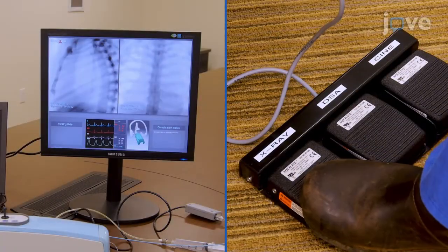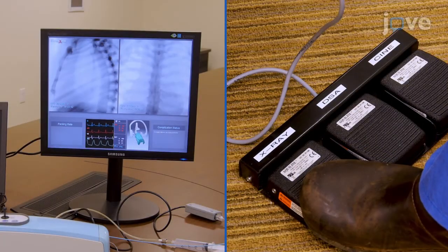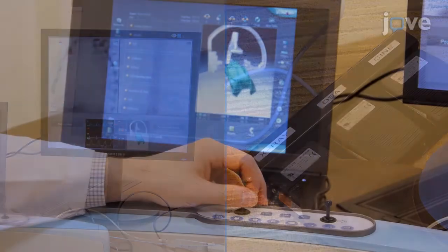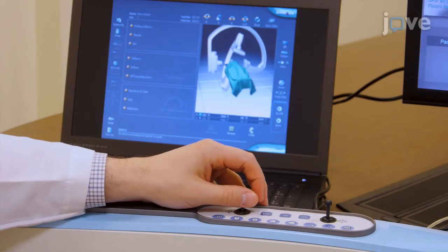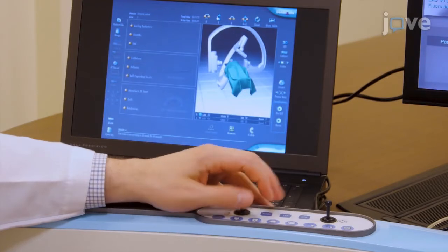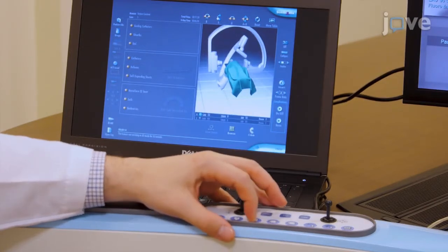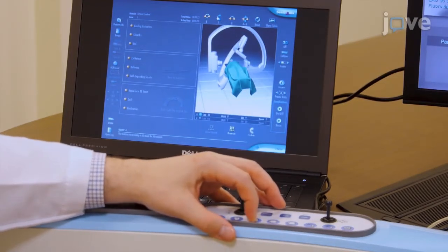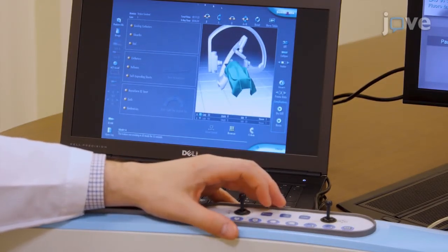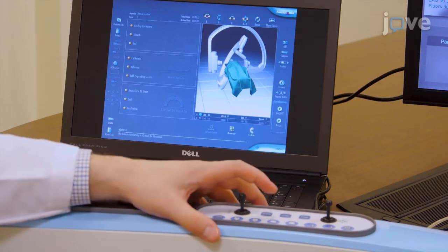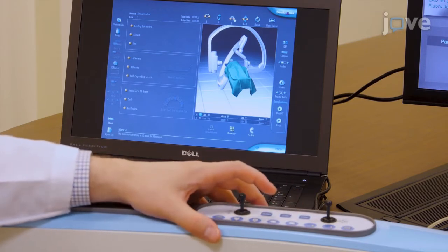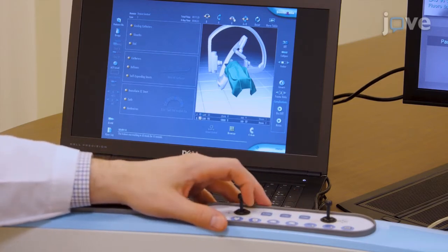Activate the fluoroscopy with the foot pedals and use the joysticks to adjust both the patient and image intensifier positions until the correct postero-anterior and lateral views are obtained.